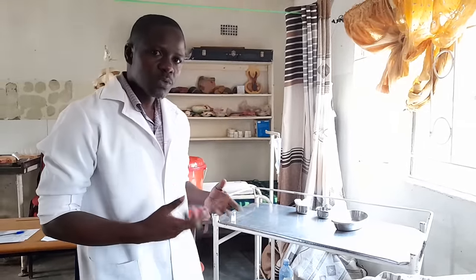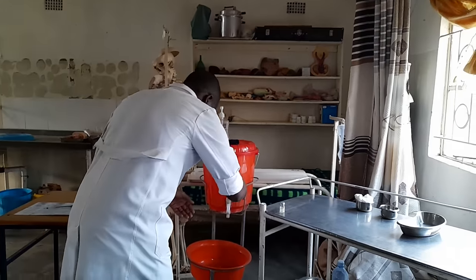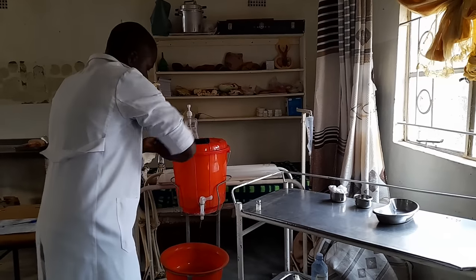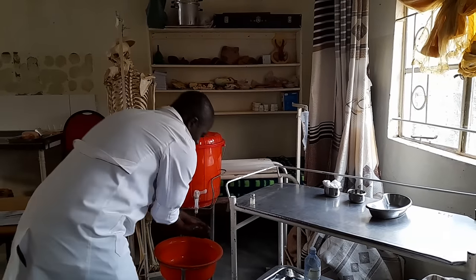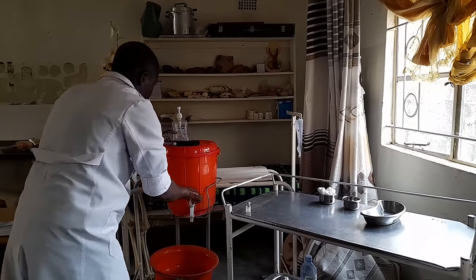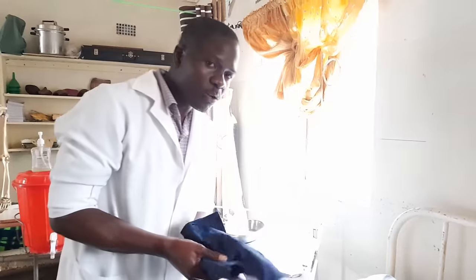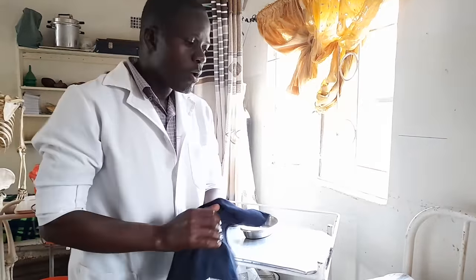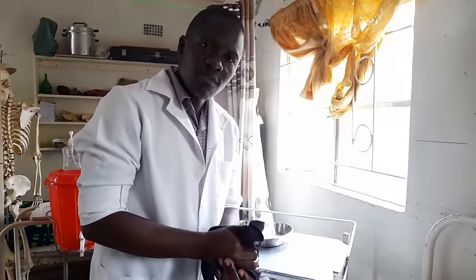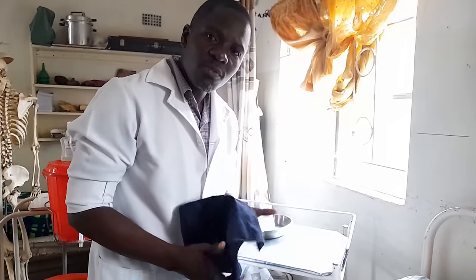As you start, as usual you wash your hands. Then you come to the patient: 'Good morning Mr. Luwoya.' Then introduce yourself: 'I'm student number two and I've been assigned to give you an injection. Is there anything I can do for you before I begin?'